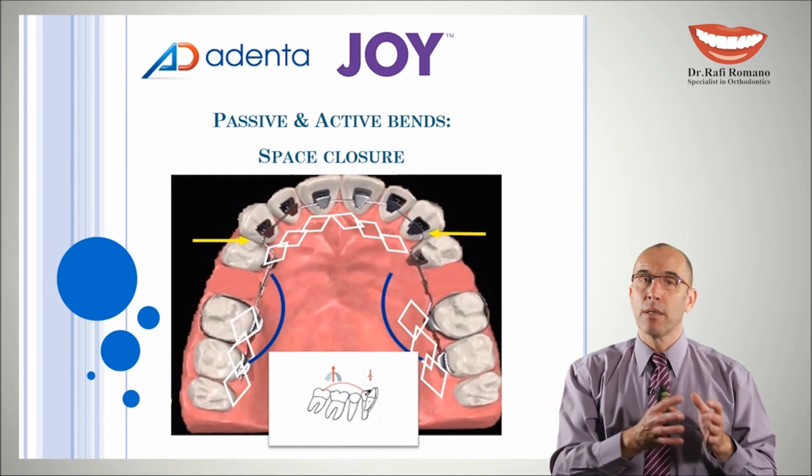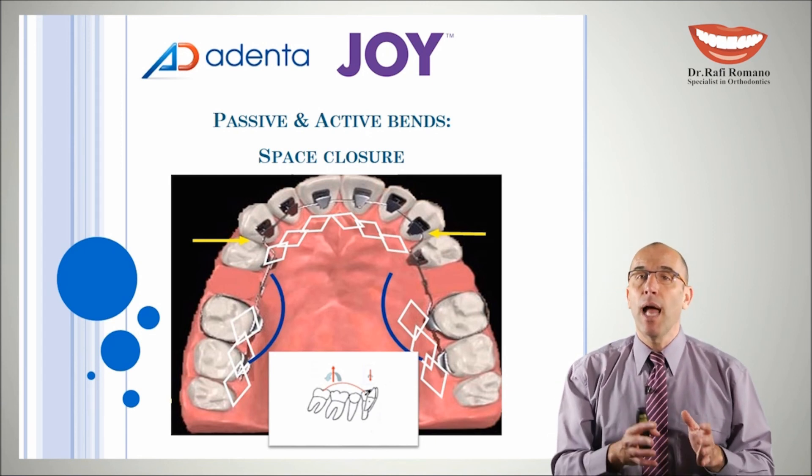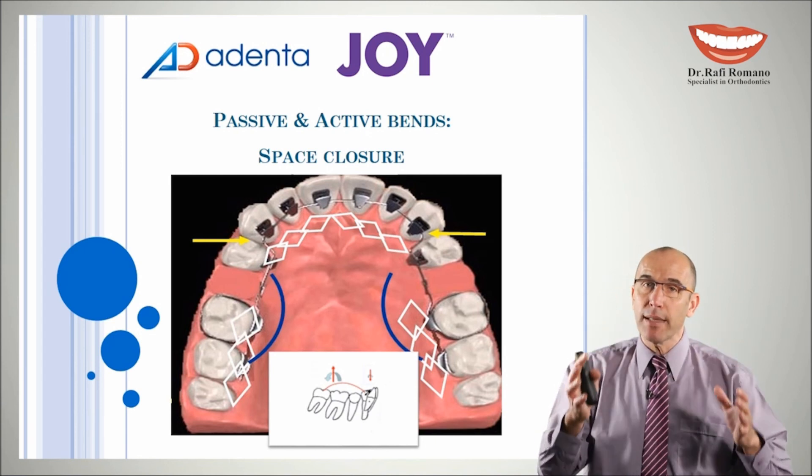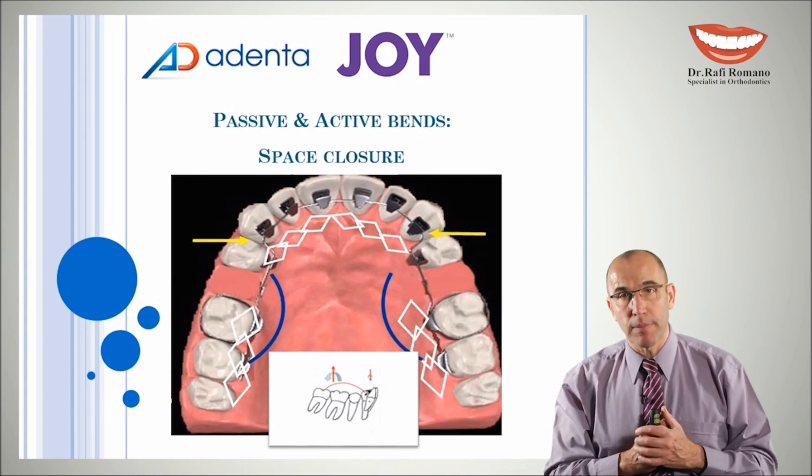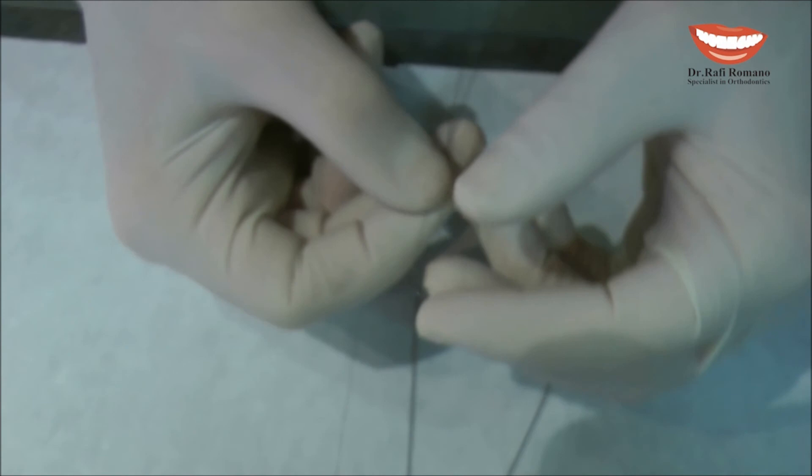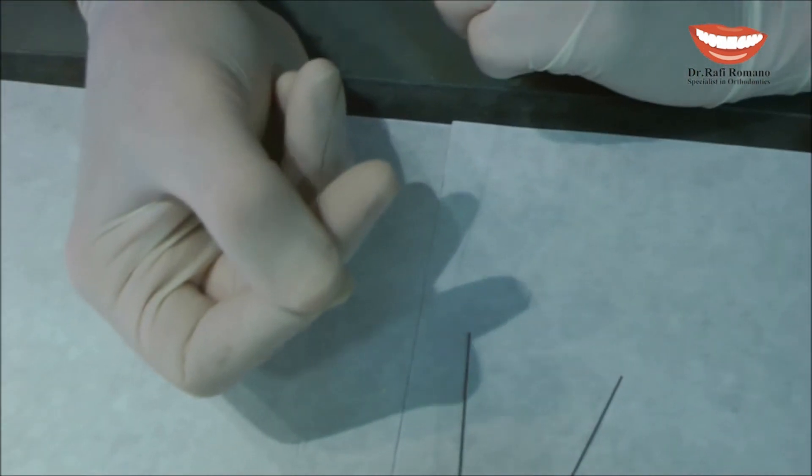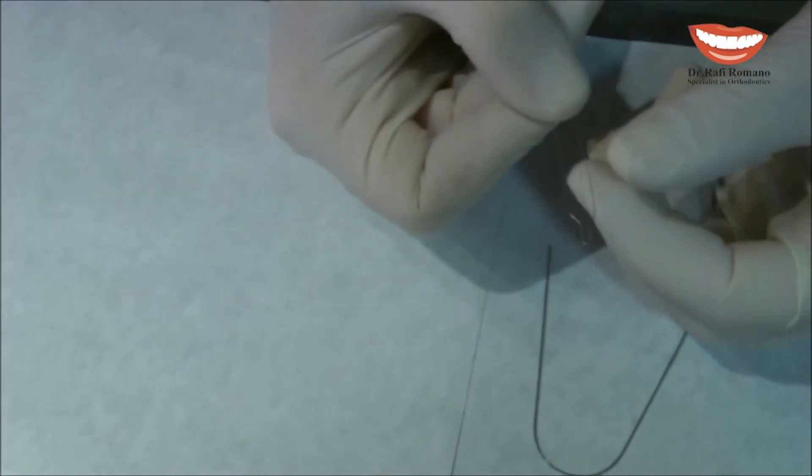So we will learn in this hands-on part how to do this complicated wire for space closure step. For this purpose of the exercise you will use metal ligature.